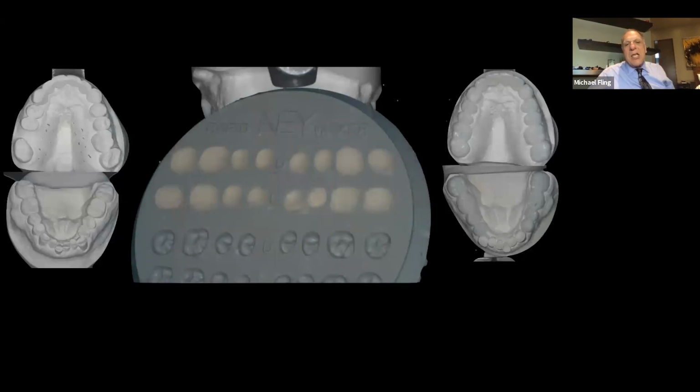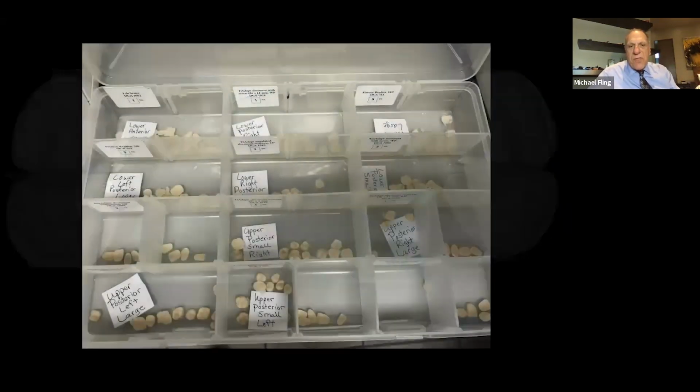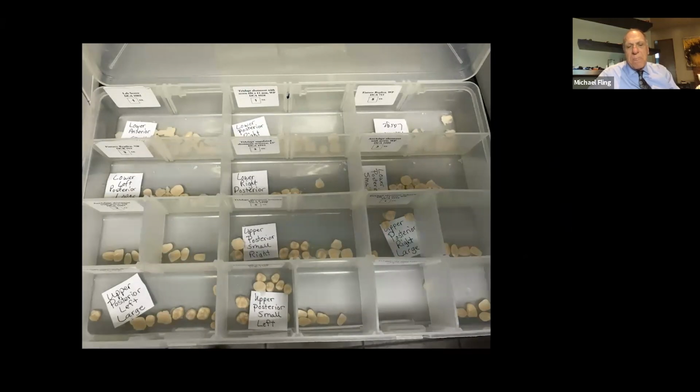So again, I utilize some of these techniques with what I'm going to train you to do with this shell overlay technique. So here you see I put the stuff in there, and I just keep it in different Tupperware things at the office. We've got these teeth in here and labeled. So if I want to grab an upper left molar, here it is. I've just got all those pre-done, and so I'm doing wax ups. The teeth are there, and I have access to them, and off we go.